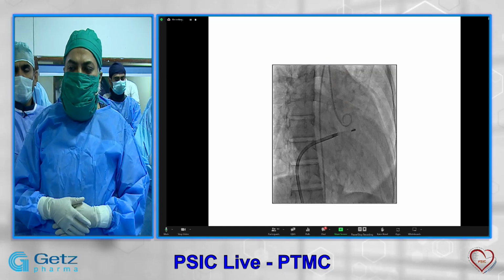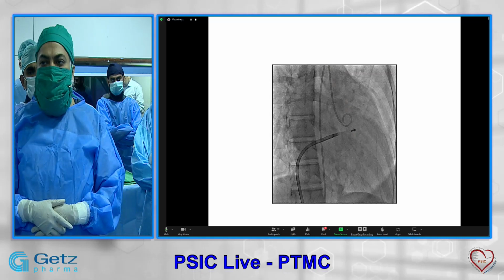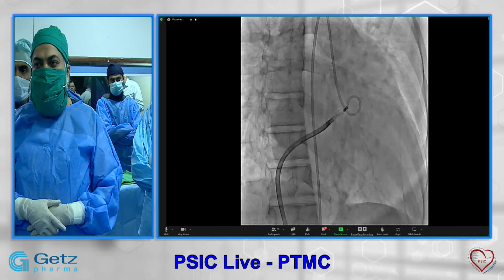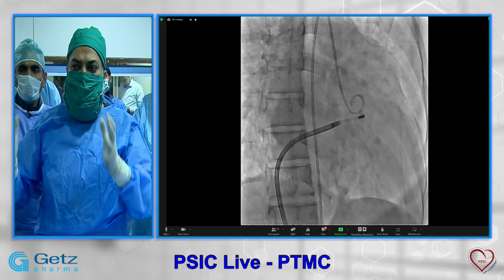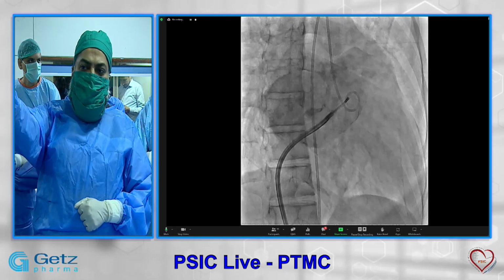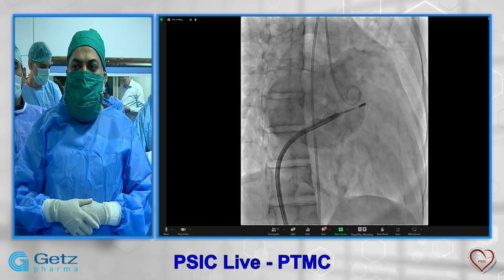And this is just for the juniors to understand the fluoroscopic anatomy of the heart. Can you please run this slide? So in this one, we deliberately injected through the LA so that we can see what we see in our heart and where the LA is. You can see the appendage up there, and this is the whole LA, and the mitral valve is just below the balloon.